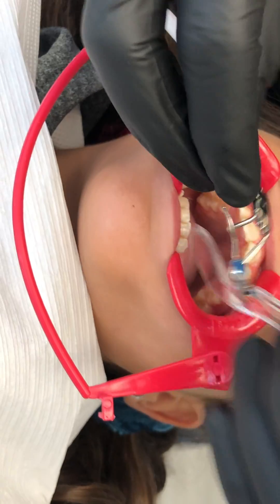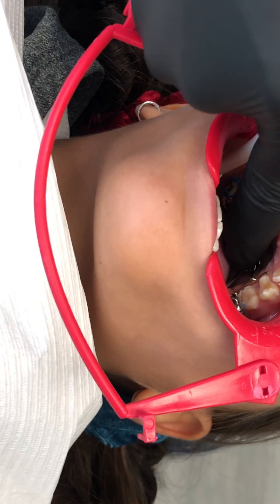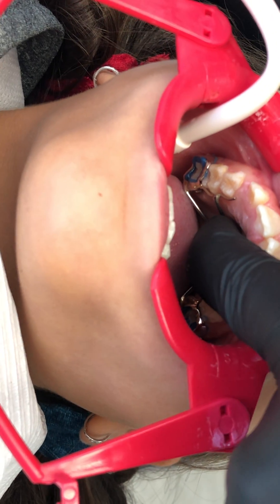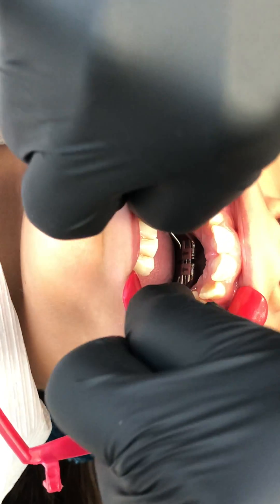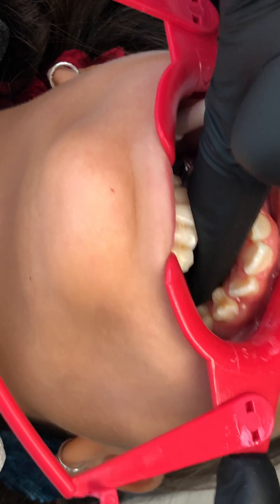Here's our loaded expander with the BandLock. We're going to seat it with light to strong finger pressure, then take two cotton rolls and have her bite in place and squeeze really tight to fully seat the appliance.